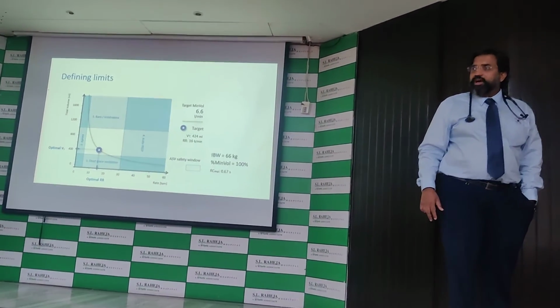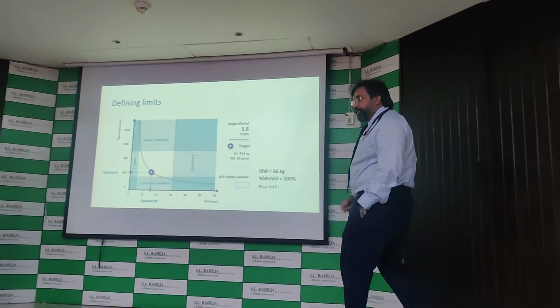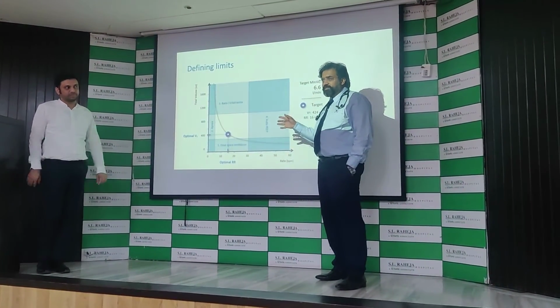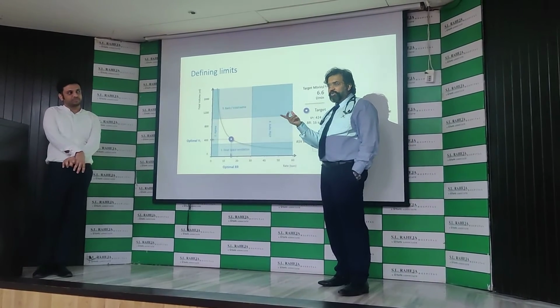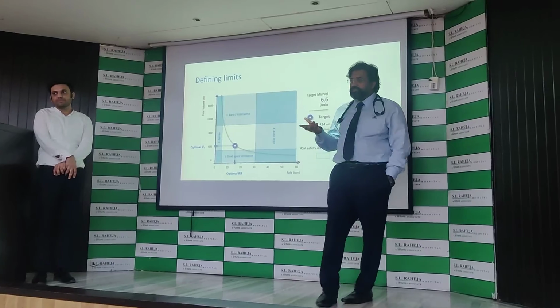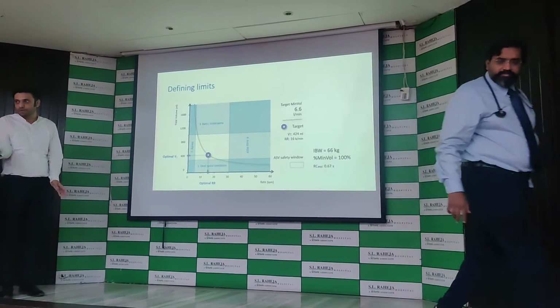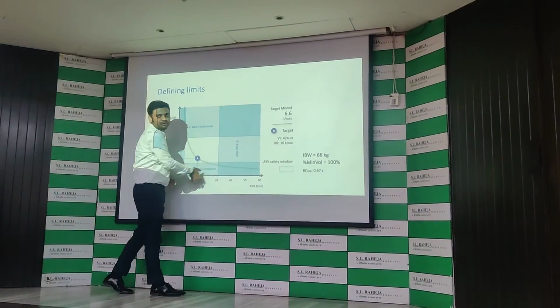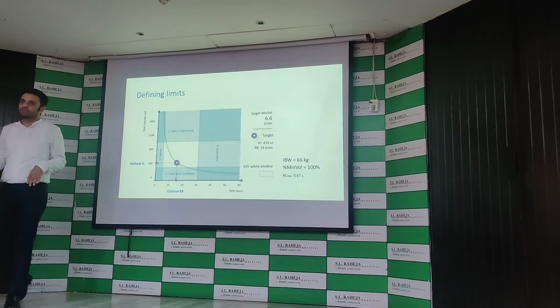Because as it is figuring out the compliance and resistance, it will change. The time constant will come to know. With that, it will understand that the auto-PEEP is changing, this is changing, that is changing. So it might change. If the compliance comes down and the patient is going more restrictive, the safety box will change to bring the target to less.